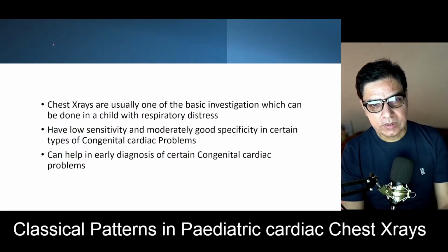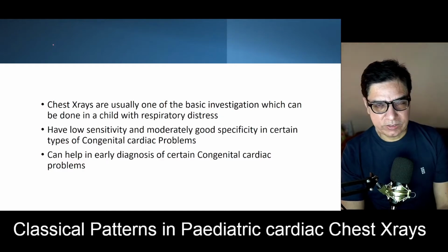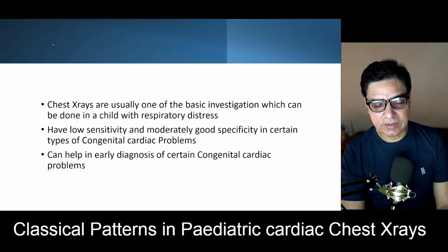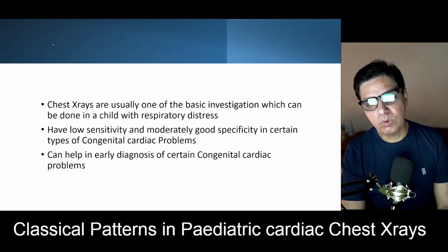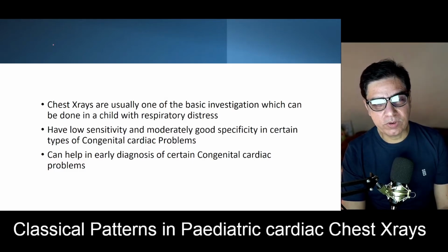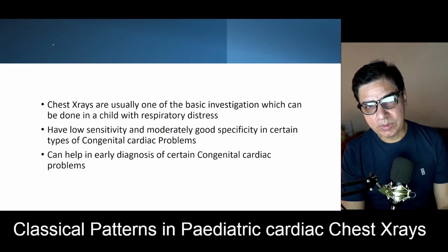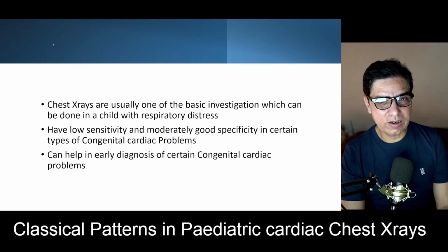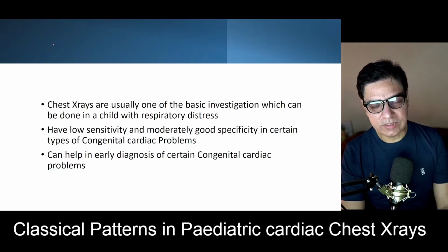One thing about chest X-rays in the context of pediatric heart diseases: most of the time we use chest X-rays for respiratory problems, but once in a while we can do it for cardiac reasons as well. Remember that chest X-rays, as far as cardiac problems are concerned, have very low sensitivity.